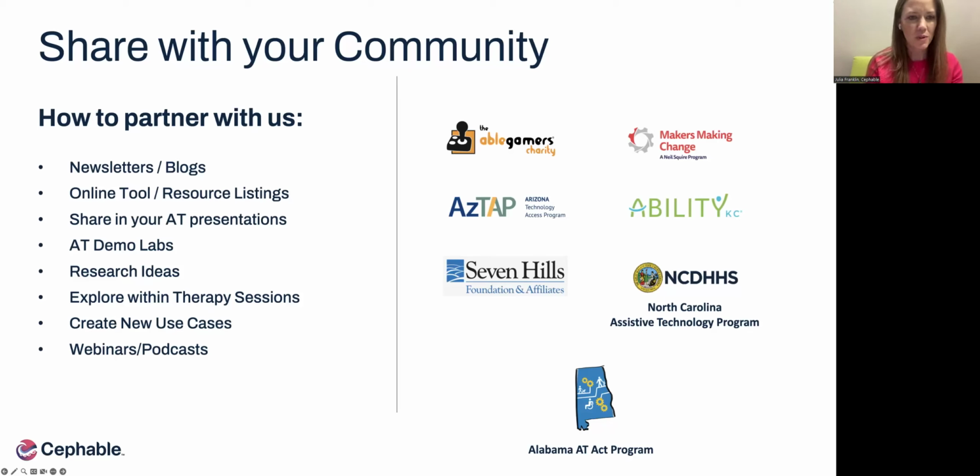And so just a couple of highlights of ways that we've had some community partnerships be really successful are through being shared in newsletters and blogs and webinars such as this, getting listed on any online assistive technology resource pages. Even live demo labs have been successful. We, of course, have therapists who are integrating it into therapy sessions and people coming up with research ideas. And just exploring ways, because different organizations have ways that they speak and interact most with their community. So we're definitely open to creativity and partnering with different folks in that way.